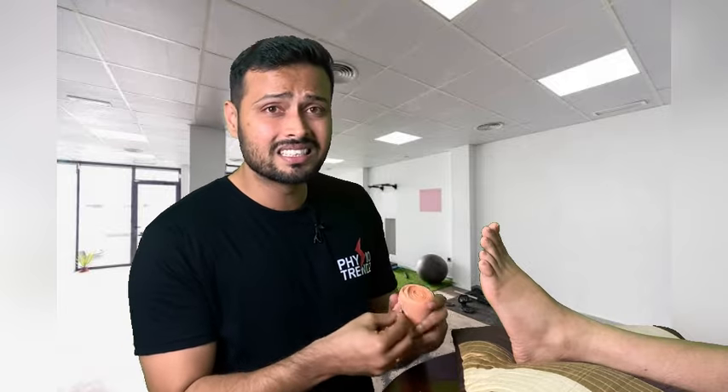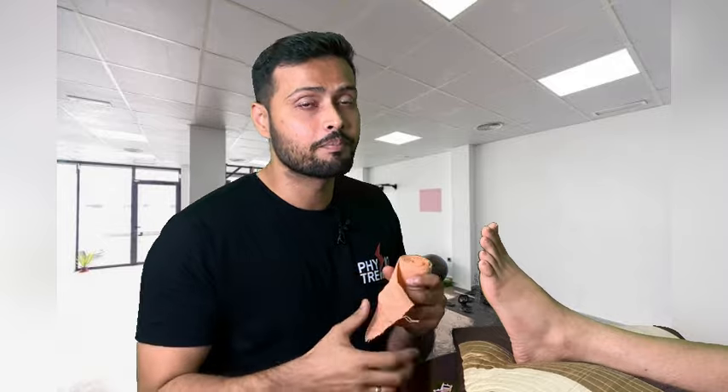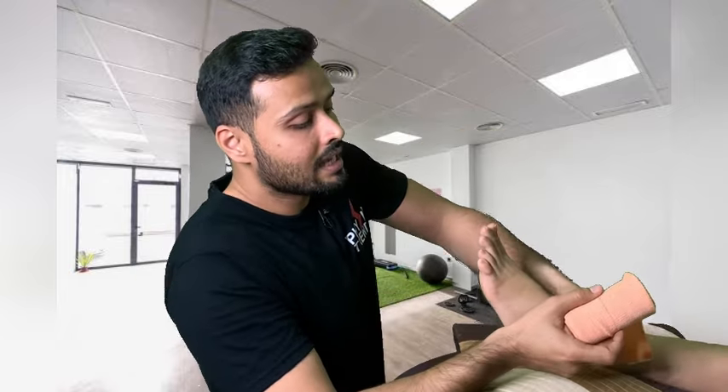This Crepe Bandage is a slightly stretchable material, but we have to make sure that when you are applying it, you are not tying it too tight, because our aim is to drain fluid from the toes towards the ankle. So we are going to start here from the ankle region.